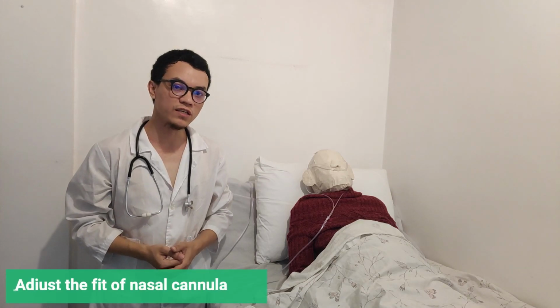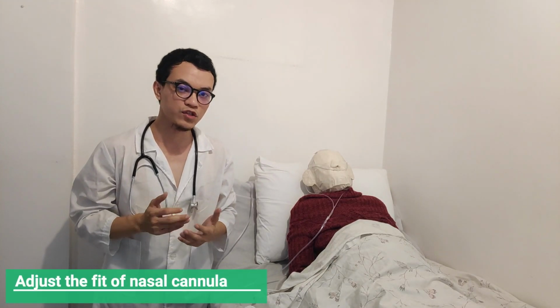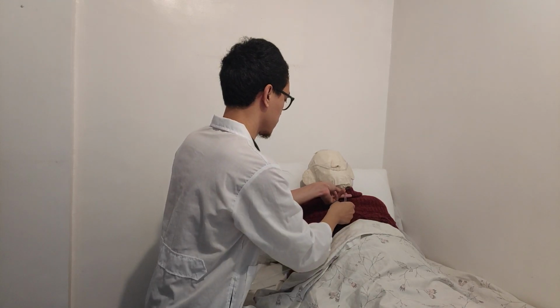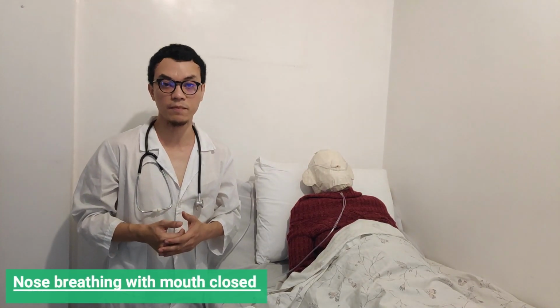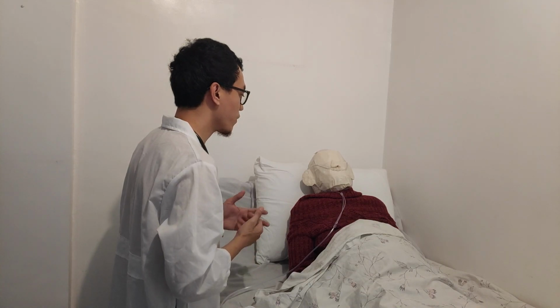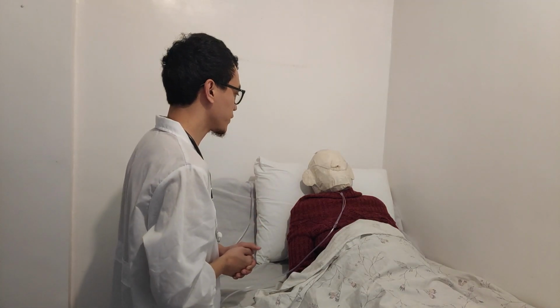Next is adjust the fit of the nasal cannula. The tubing should be snug and not too tight against the patient's skin. Next is encourage the patient to breathe in the nose with the mouth closed. Mouth breathing can cause poor oxygen concentration in the bloodstream, which can lead to high blood pressure or other medical issues. Mrs. Santos, please do your best to breathe in the nose with your mouth closed, okay? Thank you so much.